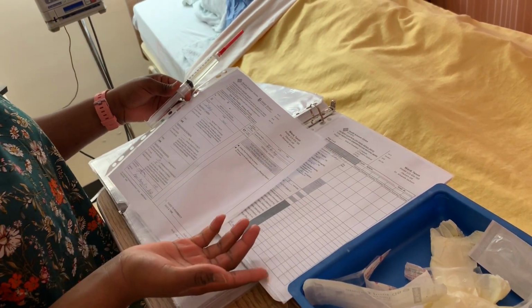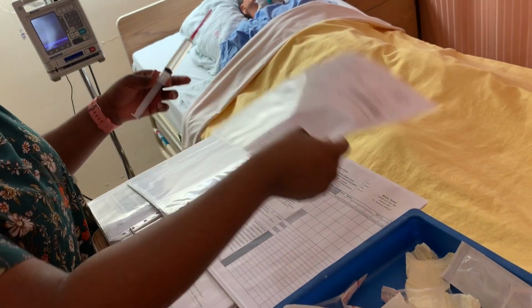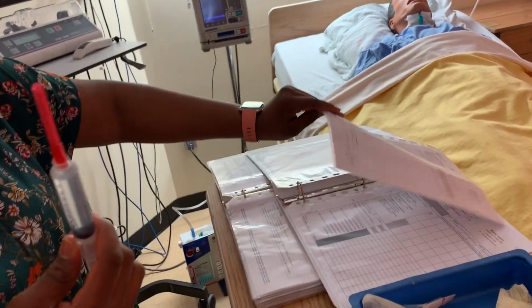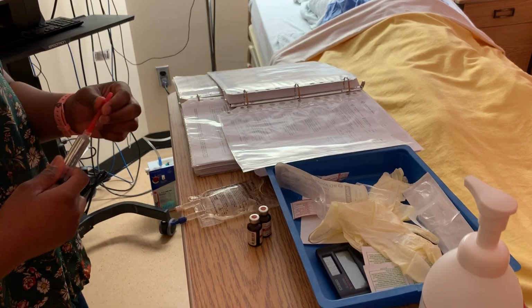Also, the PCA dose is going to be 10, as I'm going to put it on at my bedside, as well as lockout interval is going to be 5 minutes. So that's good. So I've checked my medication. So now it's time for me to dilute.